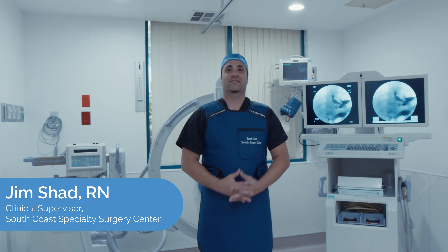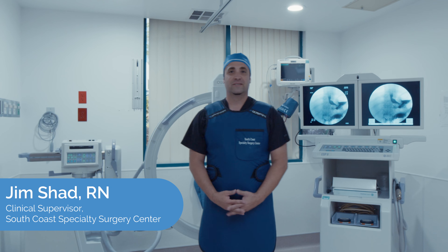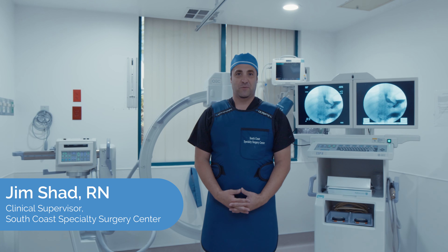Hello everybody, it's Jim Shatt, clinical director, and today I want to introduce you to one of the state-of-the-art equipment that we utilize for some of the services we provide here.